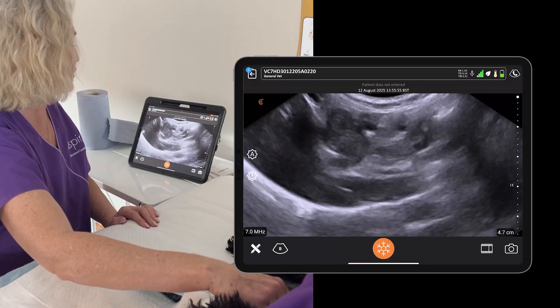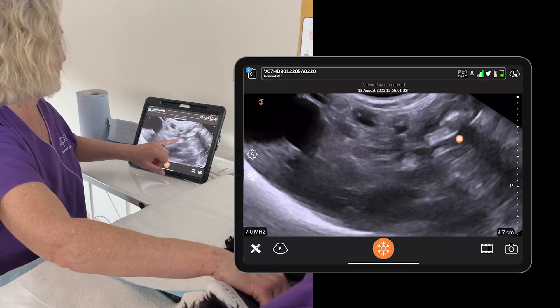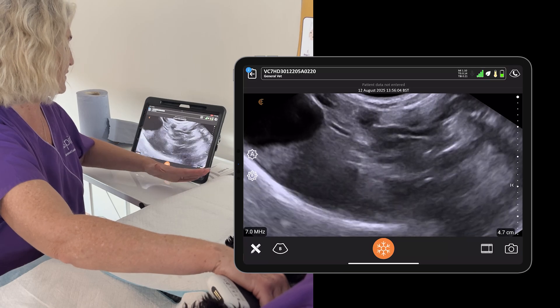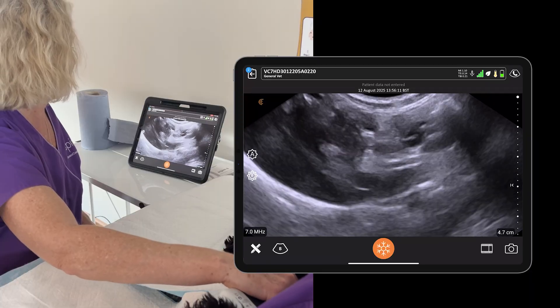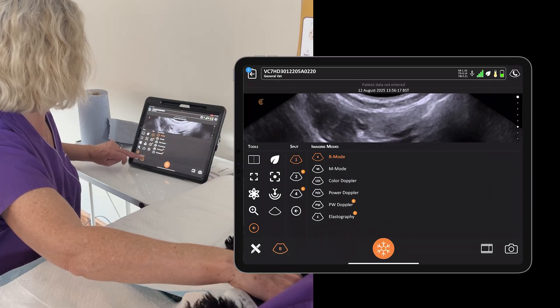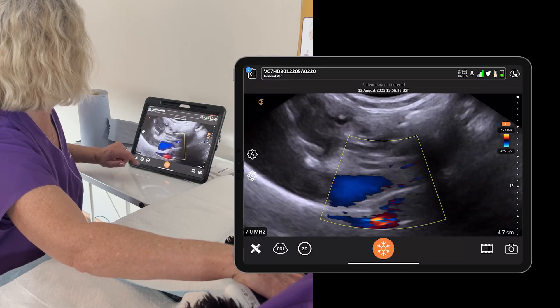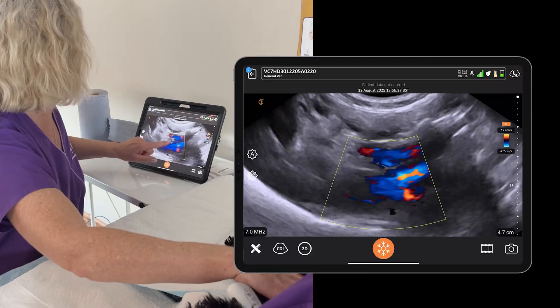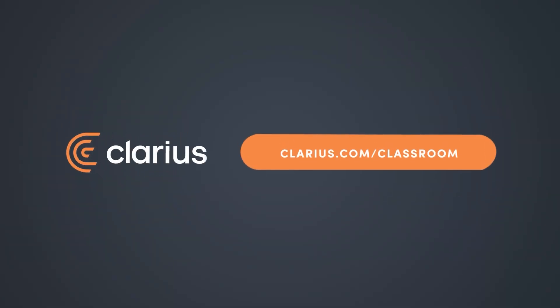It's important not to confuse the portal vein with the caudal vena cava. The caudal vena cava is lower down, then it's the aorta — there are different levels as you scan from down the table up towards the ceiling. There's our nice little common duct with our portal vein. Let's put a bit of color Doppler on it just to confirm — there's our portal vein, and this one here is the vena cava. We must not confuse the two.